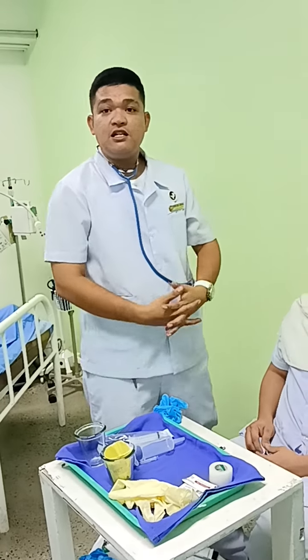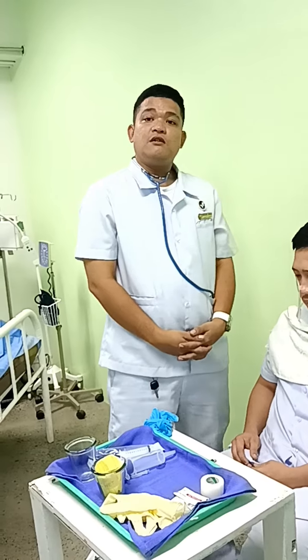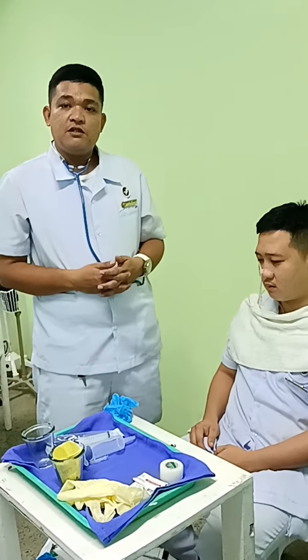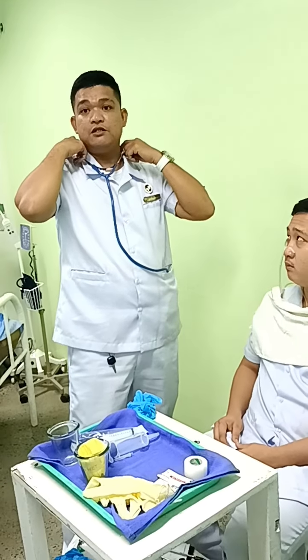Next is to obtain baseline data. We have to obtain the weight. We have to obtain the lab results. We have to check for any abnormalities in terms of electrolyte and as well the metabolic abnormalities. So next is to explain the procedure to the patient and to review the doctor's order.